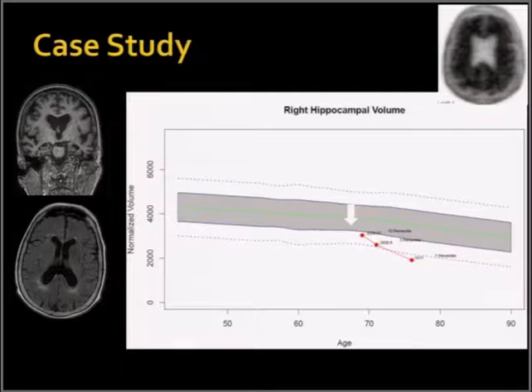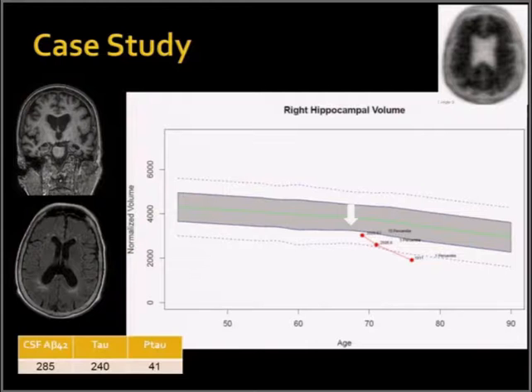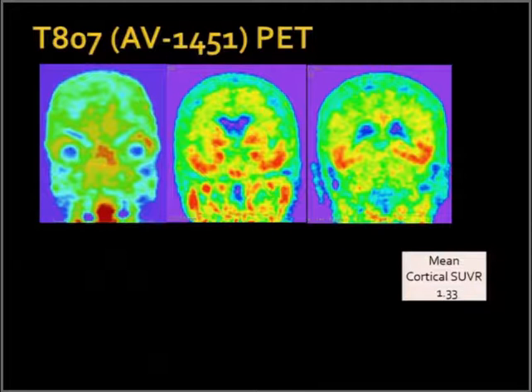And then she also has CSF staging, where her CSF beta 42 is low. For this assay, 400 would be normal, and her CSF tau and p-tau are very high. These would be maybe in the teens to be normal. So she really has all the testing that helps us come together with an Alzheimer's diagnosis. And then looking ahead to the future, the next component of how we could be staging this is going to be using tau PET scans. And this is a scan with AV1451.